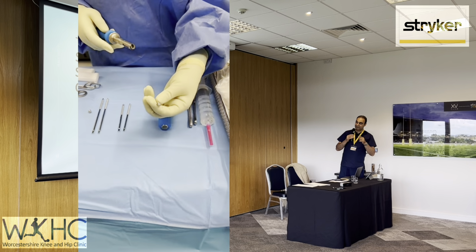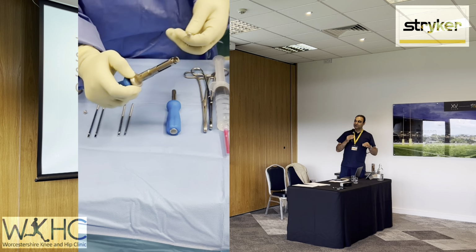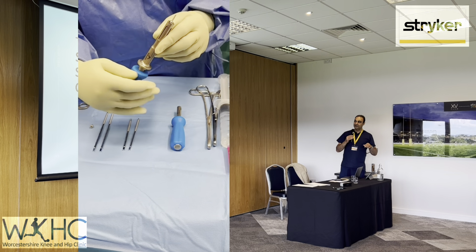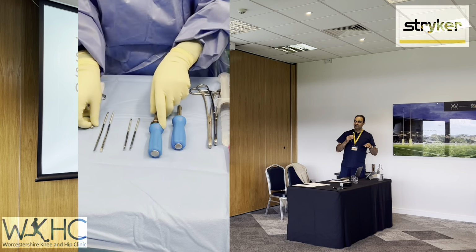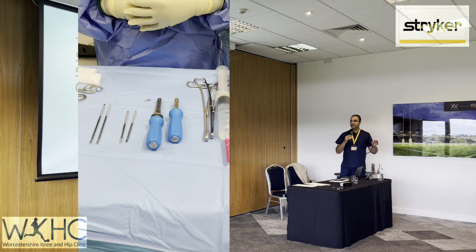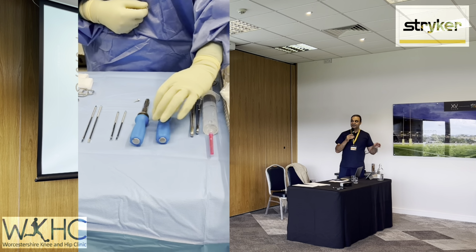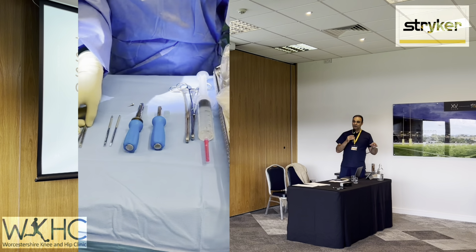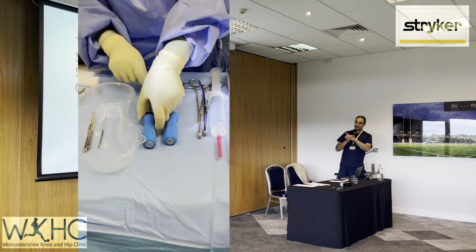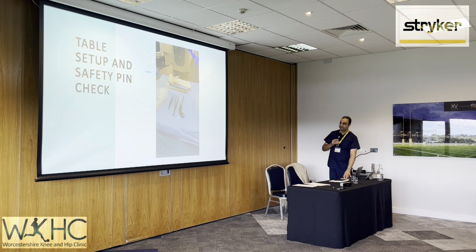And then you have these checkpoints which are placed for referencing during the operation. They're small checkpoints. One is placed on the femur, and one is placed on the tibia. You've got to be careful with these checkpoints, because when they started doing this many years ago, Mako, even in centres like Exeter, there were cases reported where the checkpoints were left in. So we have a safety checklist which we put on the wall, or you can just make a note of it, to make sure at the end of the operation the checkpoints are out and the pin lengths are similar. So that's the setup on the table.